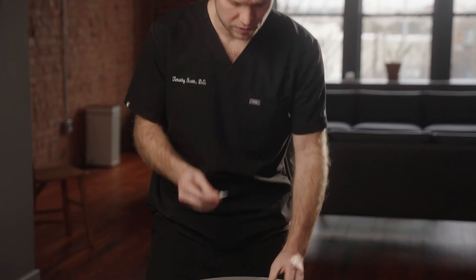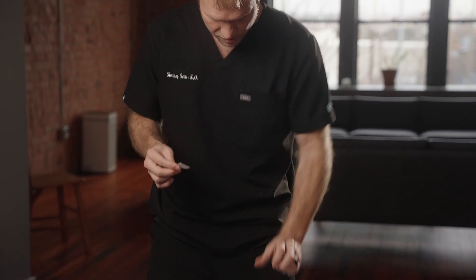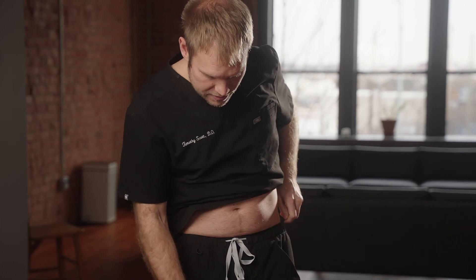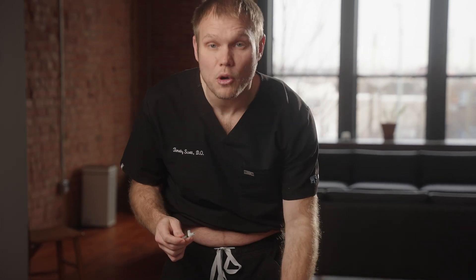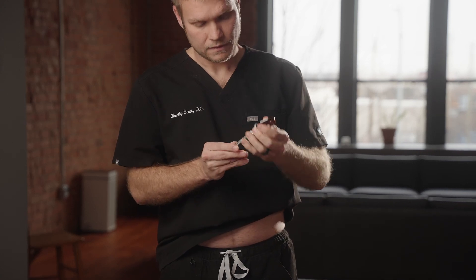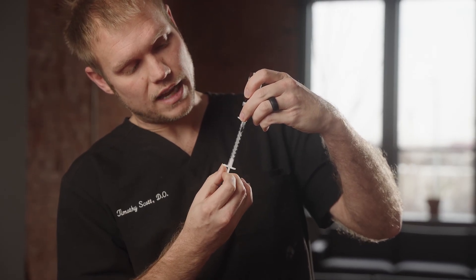First thing I do when I'm ready is clean off the top of my bottle each time. The second thing I do is clean off the spot that I'm going to inject. Next, I will withdraw — I will pull up the medication. I like to push just a little bit of air in, and then you pull down until the fluid fills to the line you're looking for.